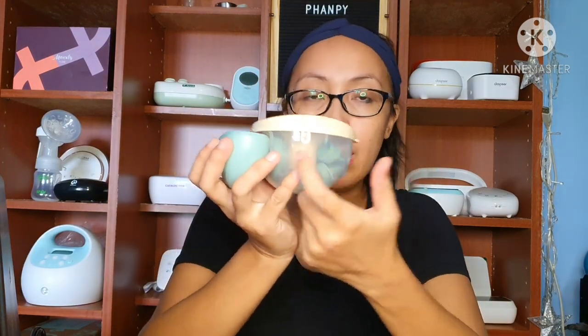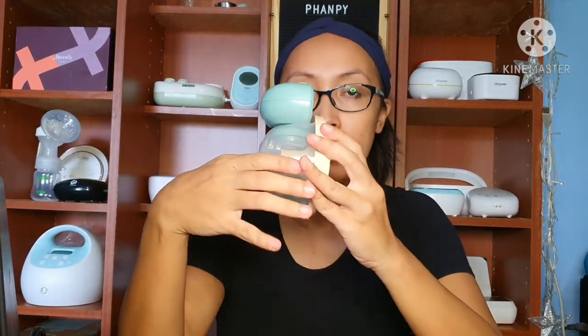Ang capacity ni PHANPY wearable ay 150ml. Ibig sabihin, 150 lang yung milk na kakasya dito. So pag nakagay itong side, may label. Rechargeable ito, pero ang advantage nito, gumagamit na siya ng Type C. Ibig sabihin, fast charging na siya — for 2 hours mo na lang siya ma-charge. Fully charged na siya.